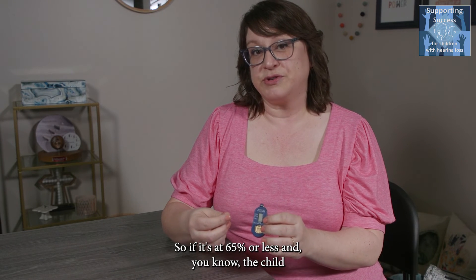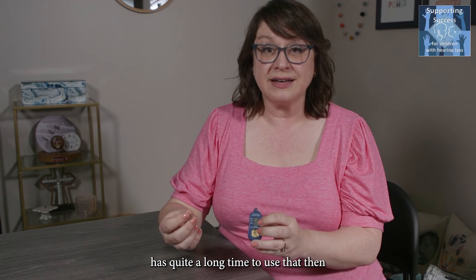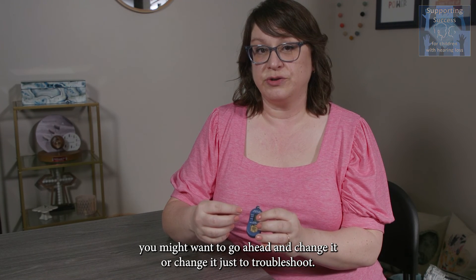So if it's at 65% or less and you know the child has quite a long time to use that hearing device, then you might want to go ahead and change it, or change it just to troubleshoot.